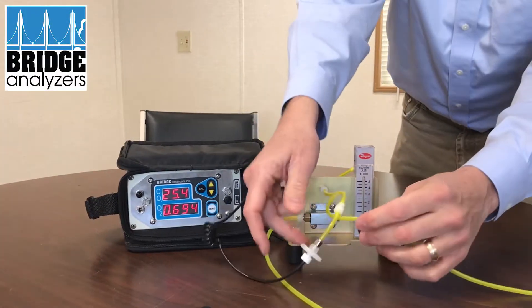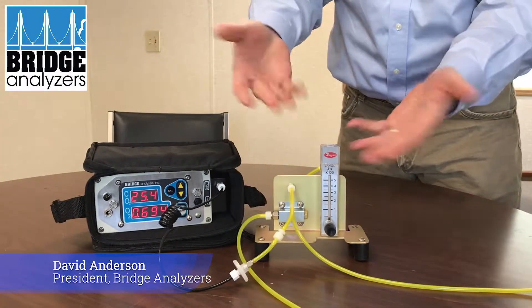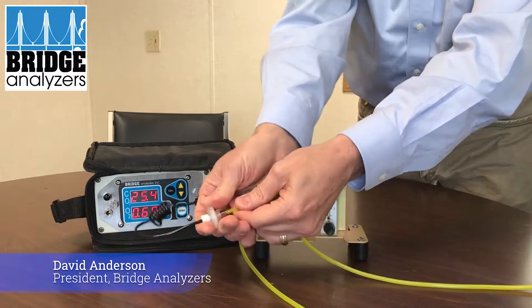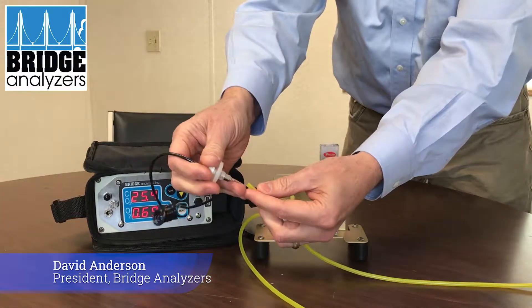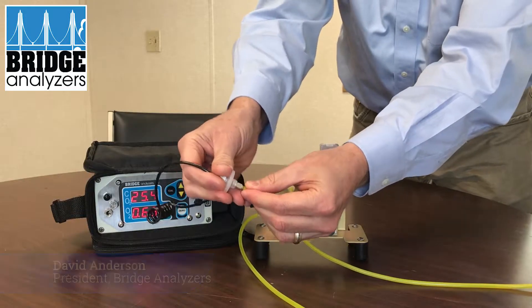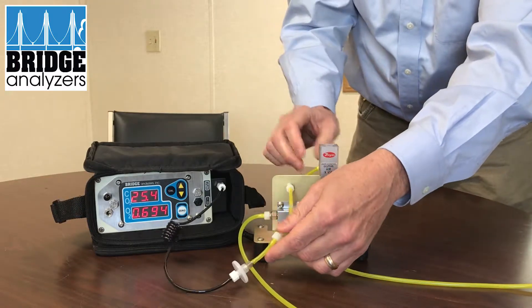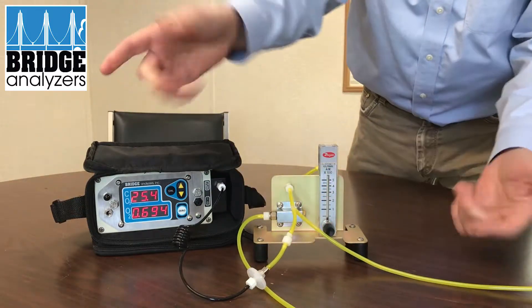What we're doing here is confirming that we're going to use calibrated standard gas. You take the needle and stick it inside this tubing, and what we're going to do is draw in the known reference gas to confirm that our analyzer is working properly.